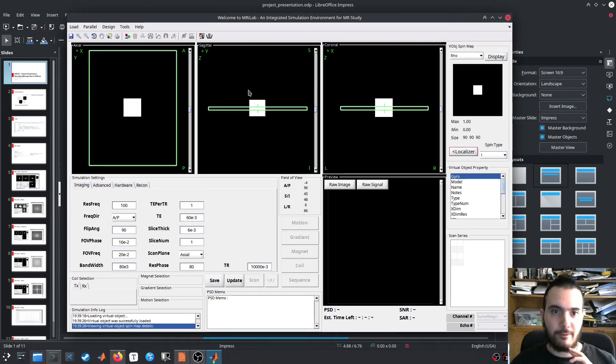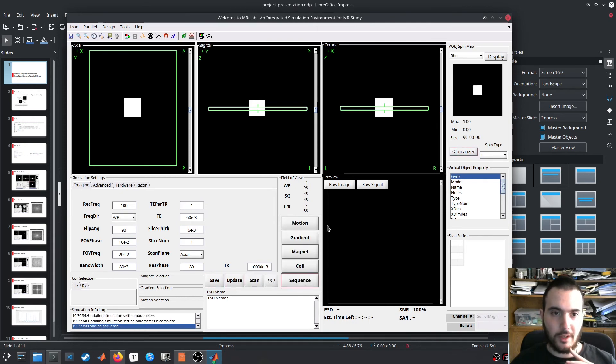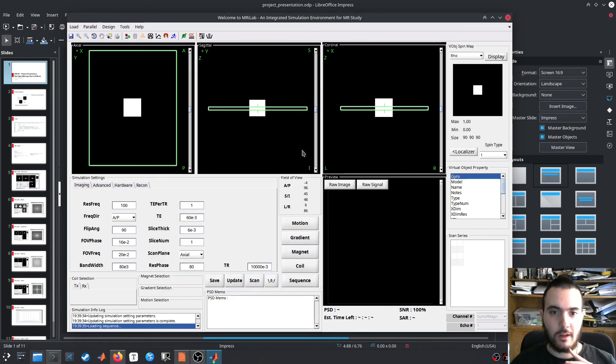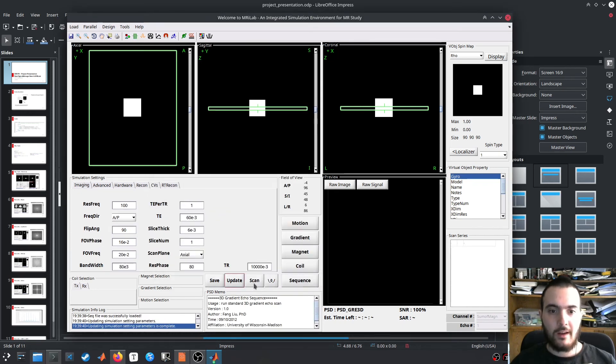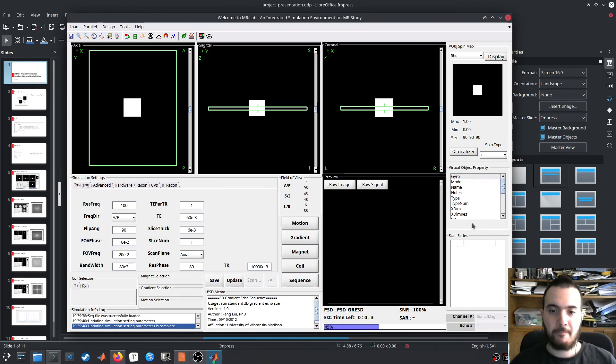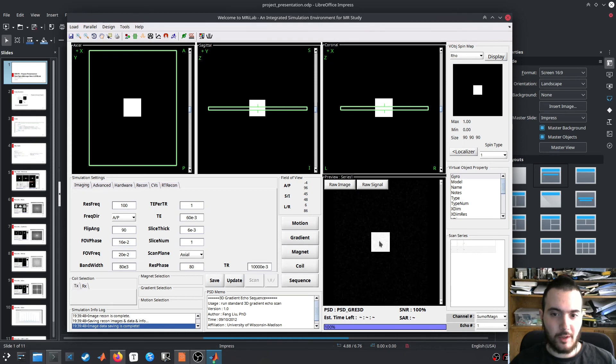Here we see the original image in axial, sagittal, coronal axes. And then after this we choose a sequence. Let us choose the gradient echo sequence. And finally we do the scan which does the simulation. Now we see the resulting image, which is the same as the original image but maybe, as you can see, a bit of noise.